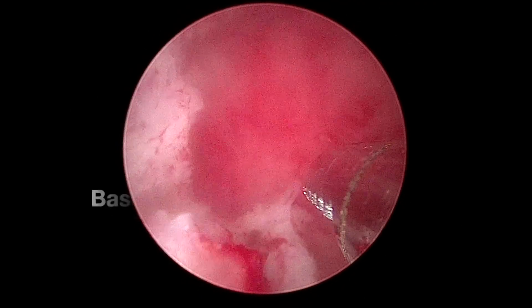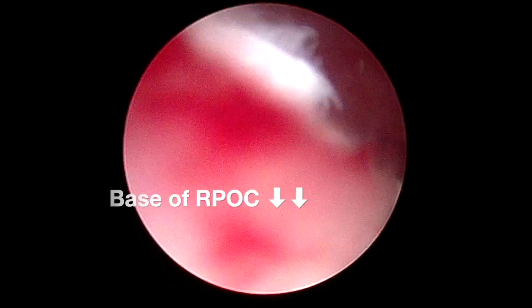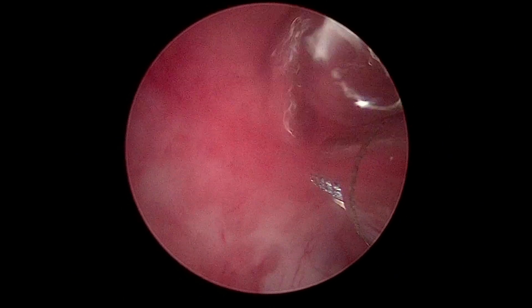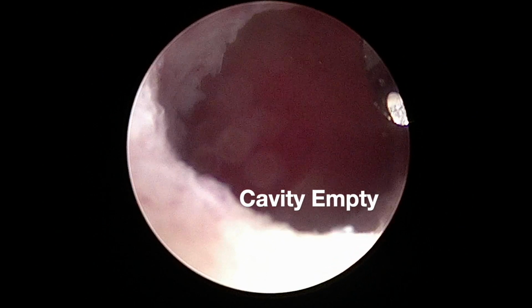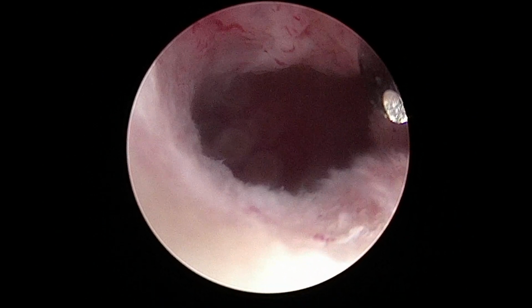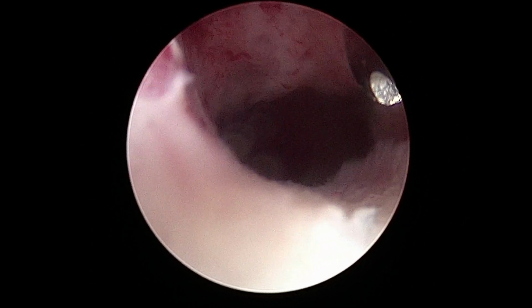Now we approach the base of the RPOC, remove whatever is remaining of the retained products. Here there is no bleeding as it is a type 0 to 1 RPOC on sonography, that is the Gutenberg classification. You can now clearly see the right ostia. So under vision, in single insertion, we empty the cavity, and as we withdraw outside, you can see the amount of fibrosis in the upper one-third of the cervical canal and at the level of the internal os.